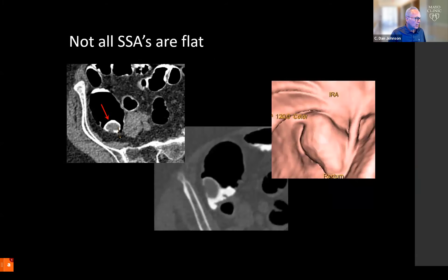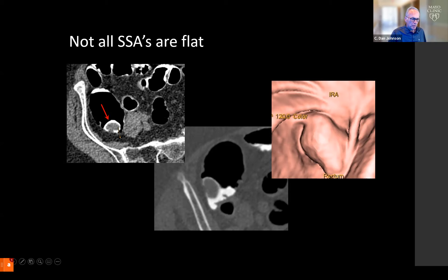Not all sessile serrated adenomas are flat. You can see a pedunculated one with the red arrow here. You can again see it on this other view — more of a typical appearing polyp.